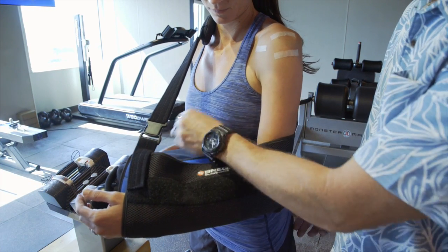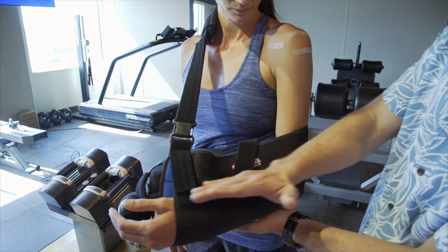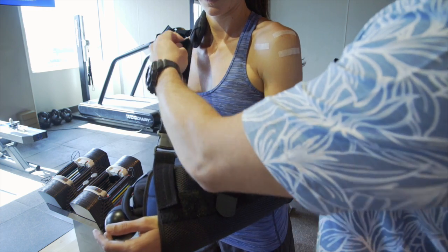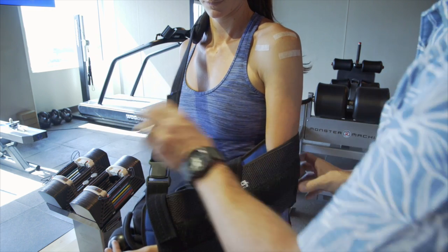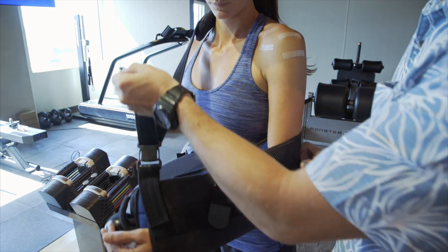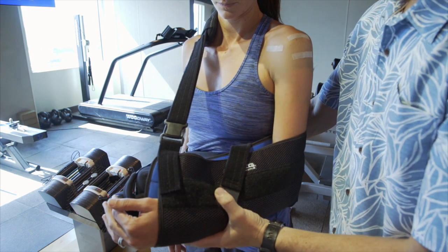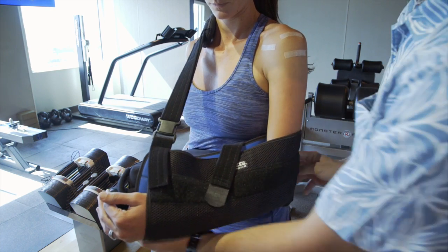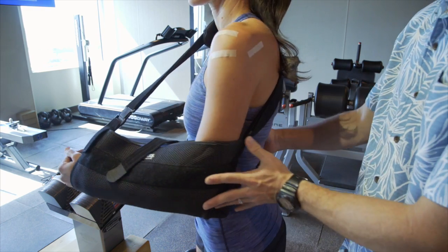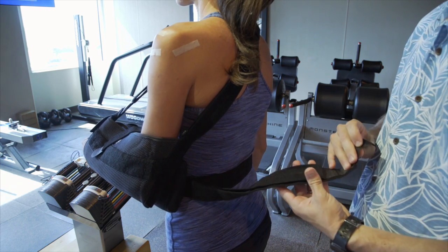You'll get used to it after two or three times. If your arm feels like it's coming out, you can undo the strap and reposition it. Her arm should be almost perpendicular to her body — I don't want your arm too far down. If the shoulder strap is too loose, the brace will feel like it's sagging off your body. Undo it, pull it up, and get it so your arm feels nice and tight. The same goes for the waist strap — the pillow shouldn't be shifting around; it should feel nice and tight. Adjust the waist strap using the velcro on the back, and you can cut it as needed.